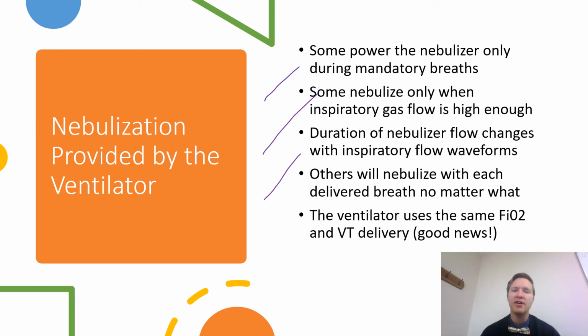Some other ventilators will nebulize with each delivered breath no matter what, whether it's spontaneous, a low flow rate, a high flow rate, square, ramp, you name it. If they're getting a breath, they're nebulizing it. So it just depends on the algorithm of that ventilator when they're creating that nebulizer mode.